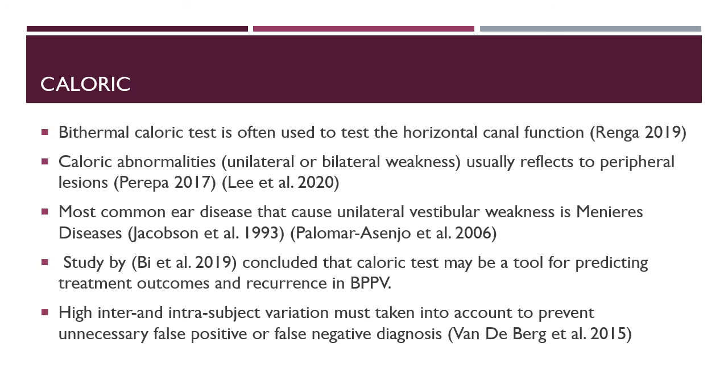I'm now nearing the end of my presentation. As a final point, I would like to highlight some studies related to the caloric test in diagnosing vestibular disorders. As we can see here, a study by Ranga in 2019 shows that the bi-thermal caloric test is often used to test the horizontal canal functions. It is reconfirmed by earlier studies done by many researchers.